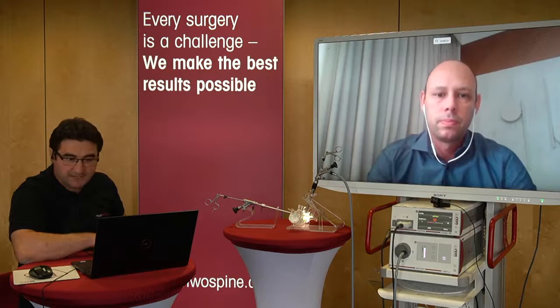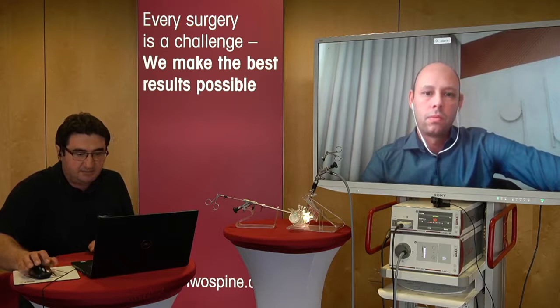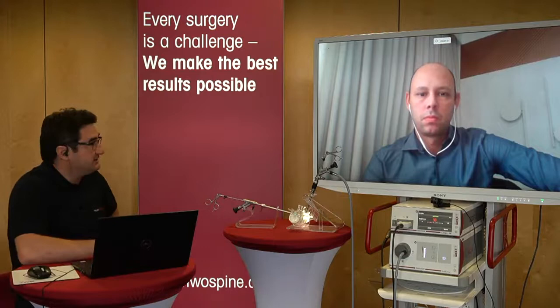Another question, from Marco: which endoscope do you prefer for lateral recess stenosis, the stenosis endoscope or the usual one? We already answered this question, but maybe some participants joined us after we answered it, so we can talk again. I prefer the normal one. But only for the lateral recess, you can go faster with the stenosis endoscope.